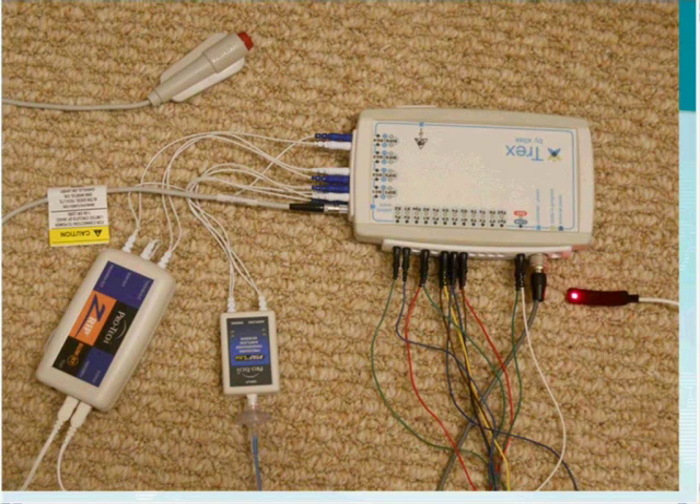Let me show you the setup I currently have. I have a Trex with an oximeter, a patient event button connected, an airflow sensor, two respiratory belts on my chest and abdomen, and some EEG electrodes connected — though not on my head — just for demonstration purposes so we have something to look at on screen. I am putting the oximeter probe on my finger right now and am about to put on my airflow sensor.